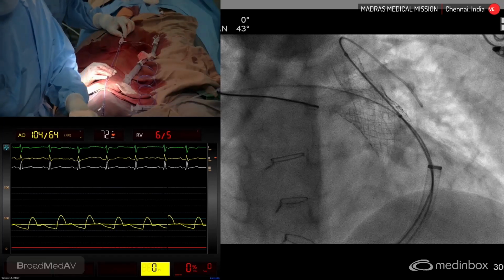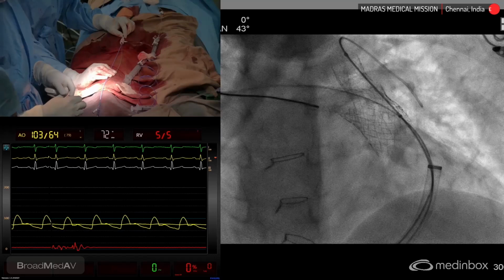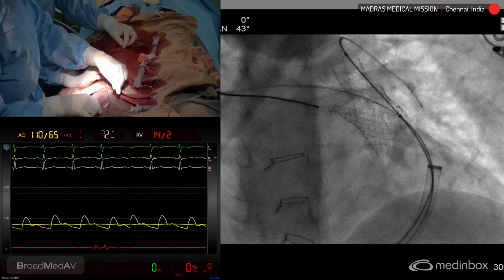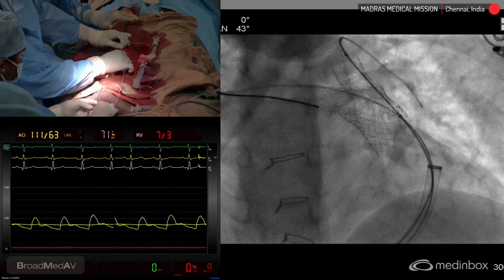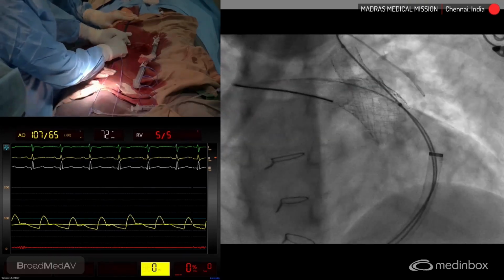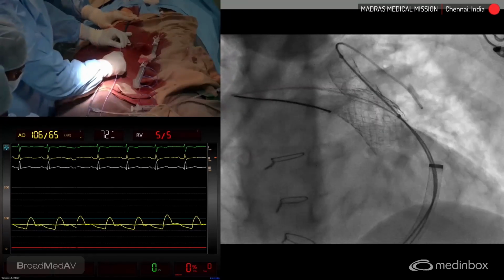Central lumen flushed. Central lumen. Yep. Connect this Armada to an indeflator. A full indeflator here. Holding the wire. Both the wires to be held. Dry gauze.